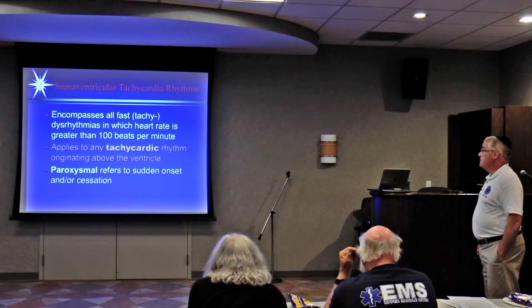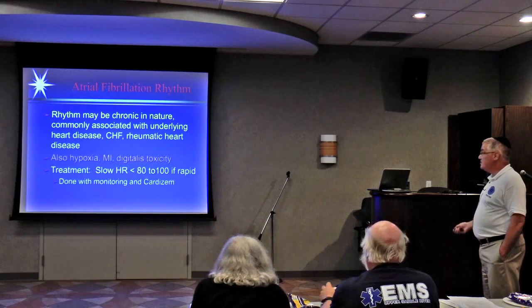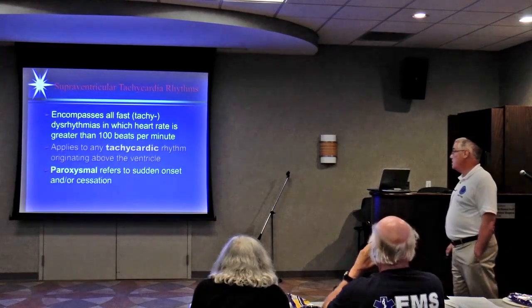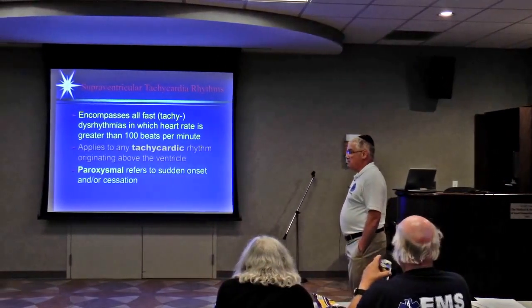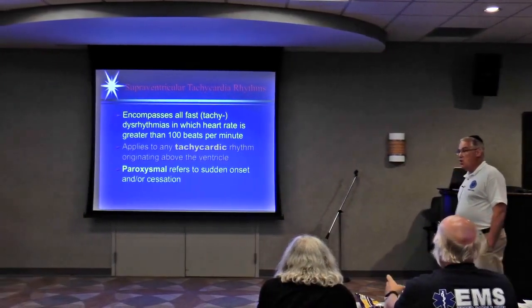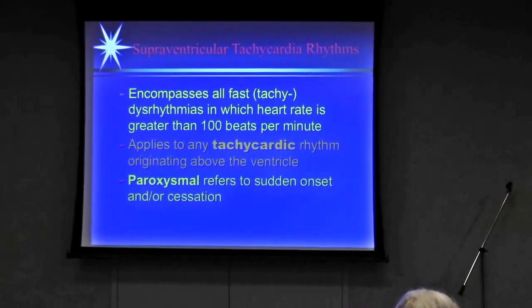Okay, so now we're going to get into one that is dangerous but not typically life-threatening: supraventricular tachycardia, okay? By definition, it's a heart rate above 100, but by real definition, it's an atrial, supraventricular rhythm over 150 or 160, above sinus tachycardia. So again, what's the danger here? The danger is the decreased ventricular filling time, and the stress and workload on the heart, okay?